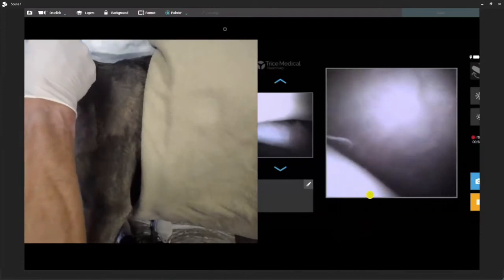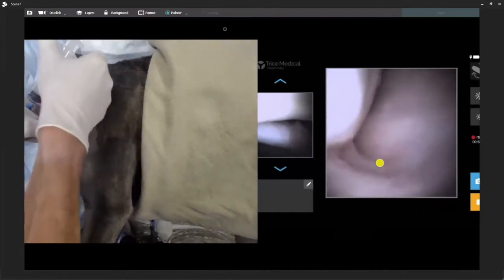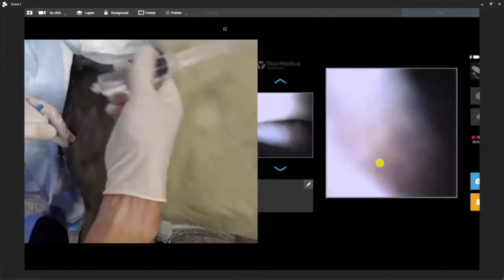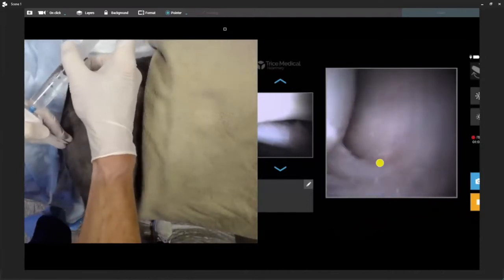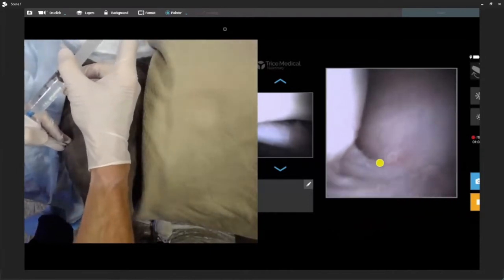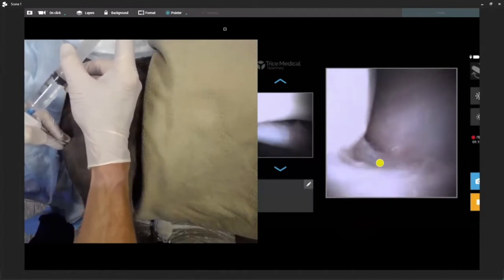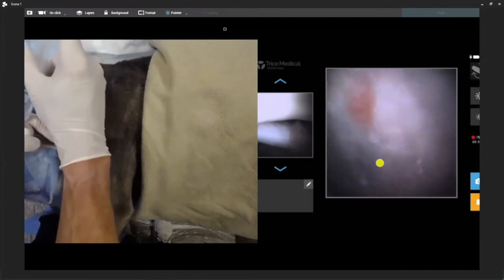The next thing is to go all the way to the caudal joint pouch. For those people who say you can't go from the north pole to the south pole — we are now as far caudally as we possibly can be. This is all the way where the joint capsule attaches to the caudal humeral head in this region. Now we're going to work all the way back up. If we had a shoulder OCD, this would typically be the location we would see it. There's our glenoid cavity as well.